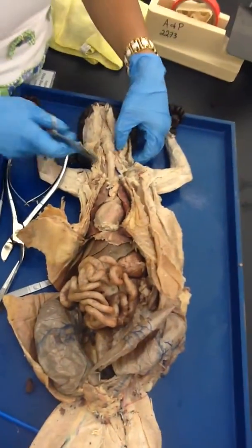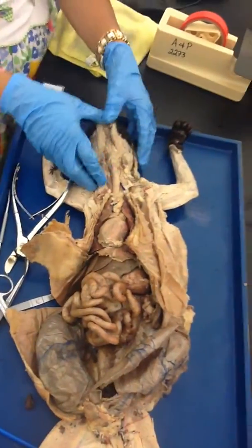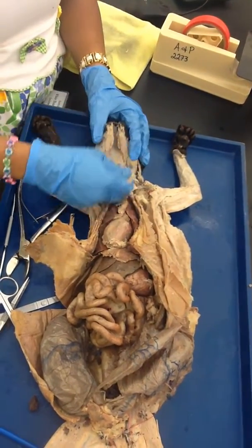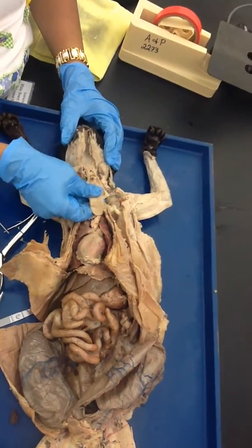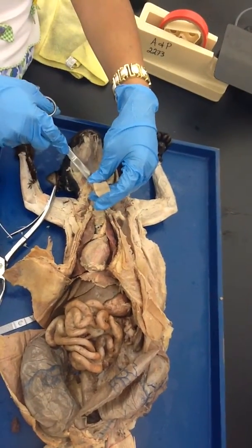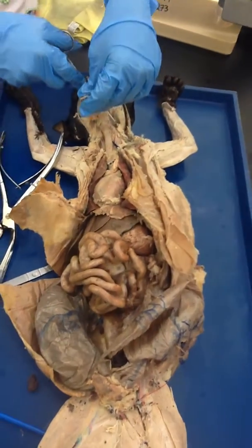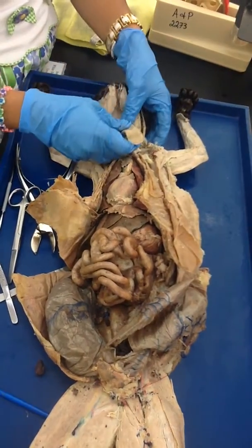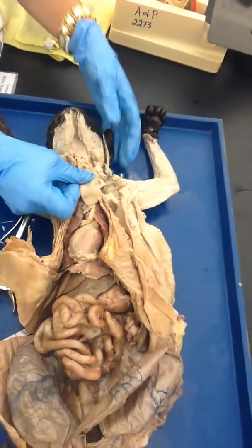Once you have separated it out, you are going to hold the tongue and pull the tongue out all the way. When you are pulling the tongue out, you may want to give a cut on the sides so that you don't rupture anything. Give a clean cut so you can pull the tongue more out.